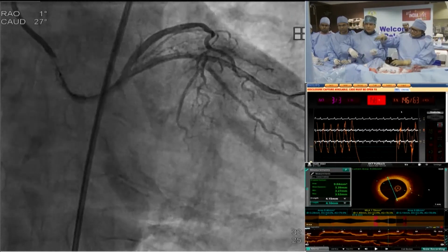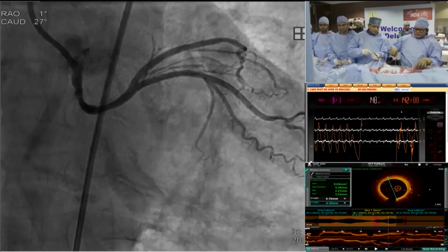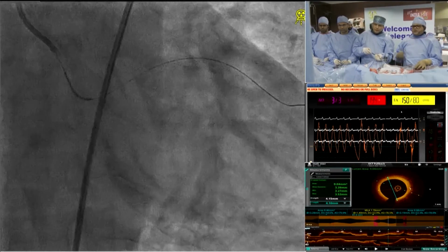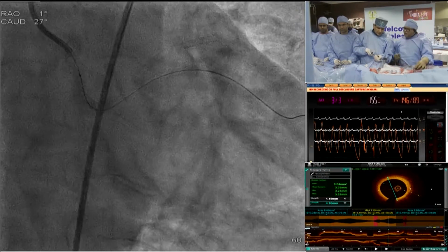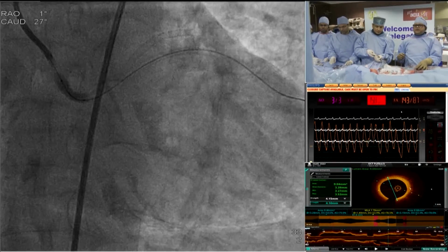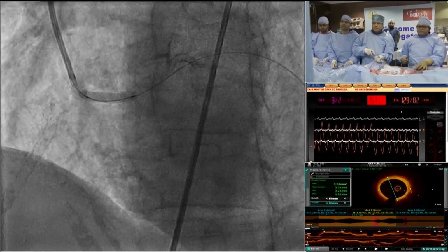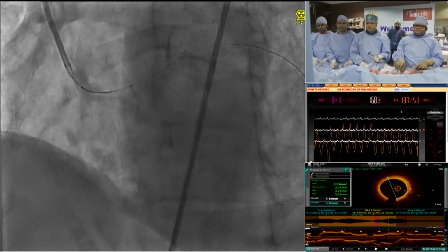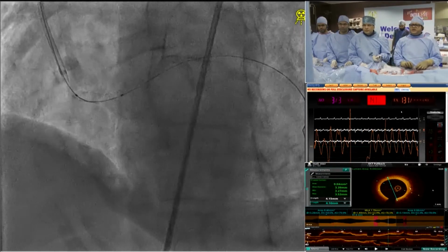Distally, no, but Dr. Sharma has a point that there is some plaque burden distal to where your stent is, but that's okay. It would have been nice to cover the whole thing, but even this should be pretty good. 12, 12, 12, 13, 13, 14, 14, 15, 15, negative. So she is okay, hemodynamically stable.